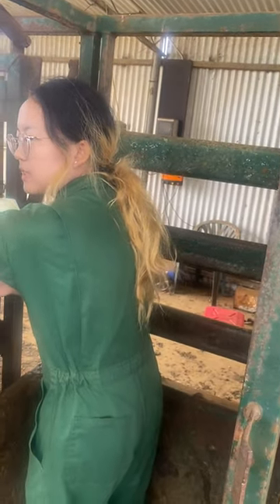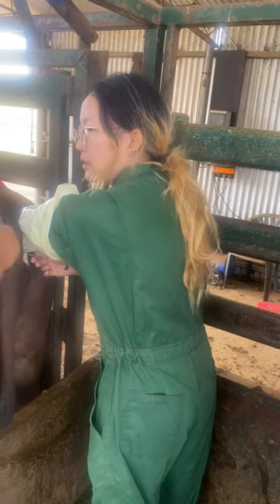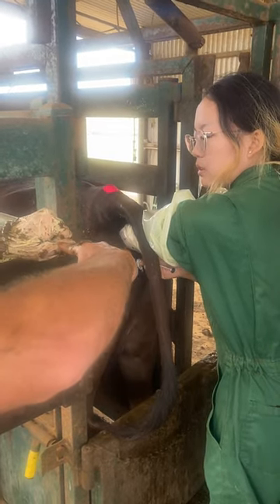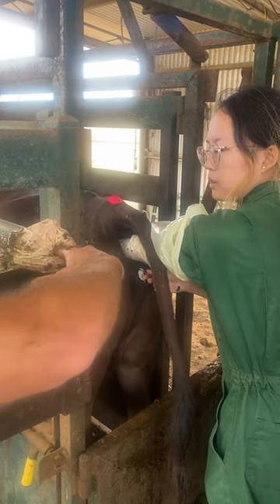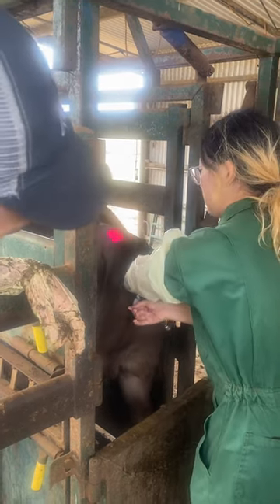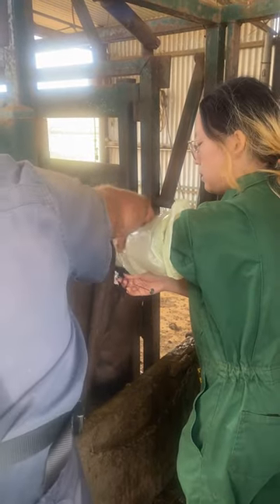So it's not in the cervix? It was when I pulled my hand out, but things might have changed — it's slightly still in the cervix. So when you pull it out, if you're kind of levering on that gun, you'll feel it suddenly come free. Currently it's probably in the cervix, but as you withdraw it, backing it out of the cervix, you'll feel it come free — scratch, scratch — then send it back in and deposit the semen. It's a little bit darker in the back, but it does look like you're doing a good job. If you've got it and you're holding the cervix over the hand, here's the vagina, here's the cervix, you're holding the cervix like this — is the gun in there?